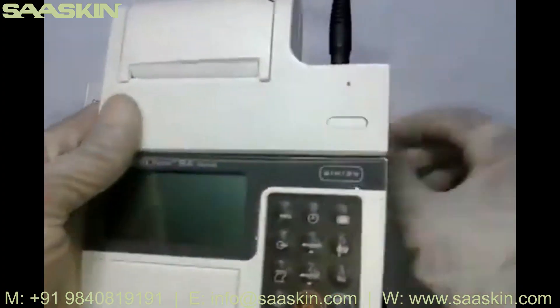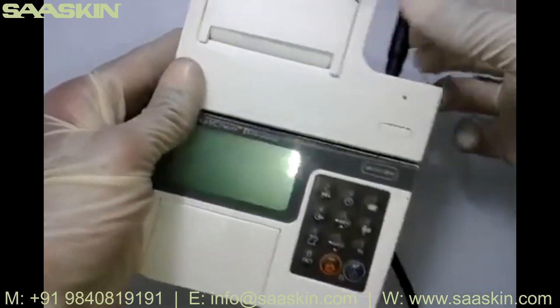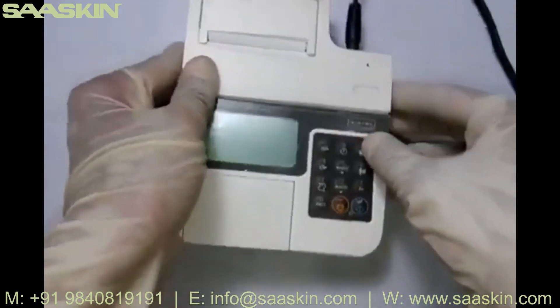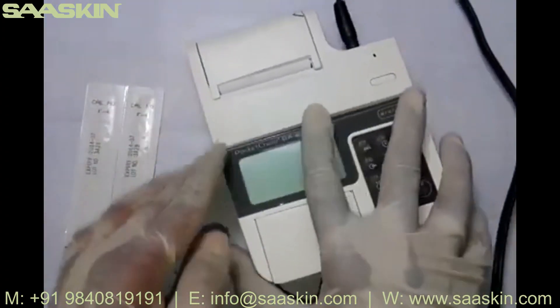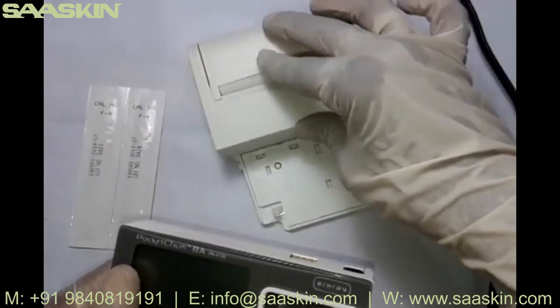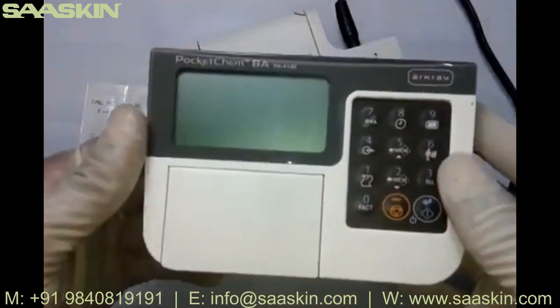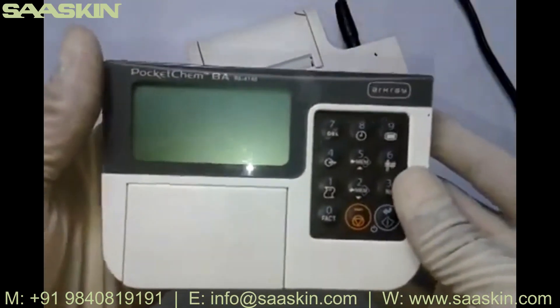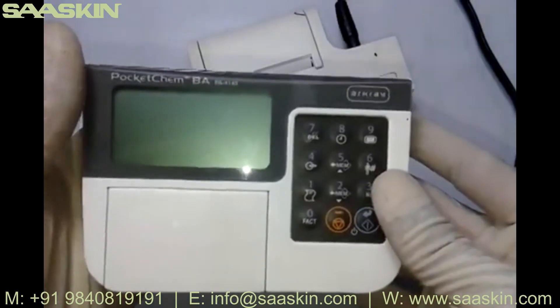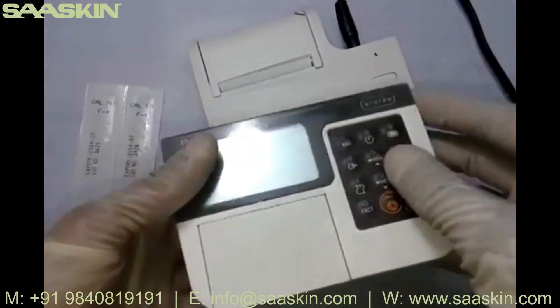There is a paper feed button — press it to confirm the power supply is connected; you'll see paper feeding out. The instrument is a two-piece unit: the upper part is a thermal printer, and the lower part is the actual instrument. You can carry just the instrument part to the patient bedside — it holds the memory.